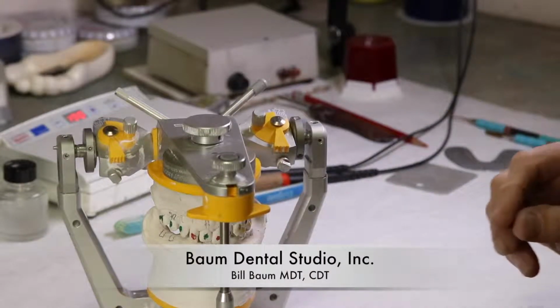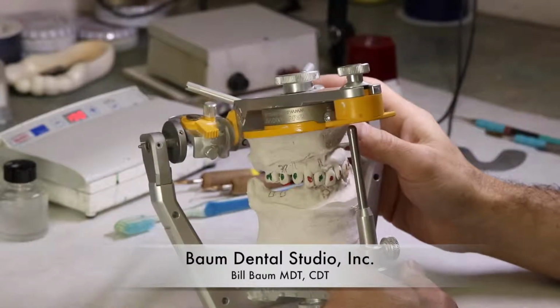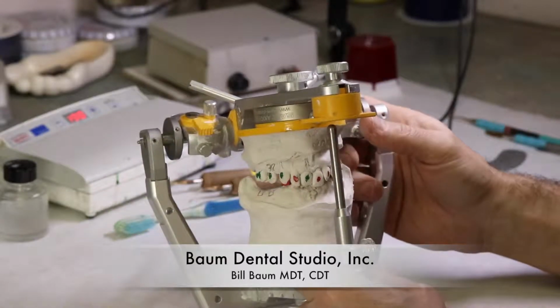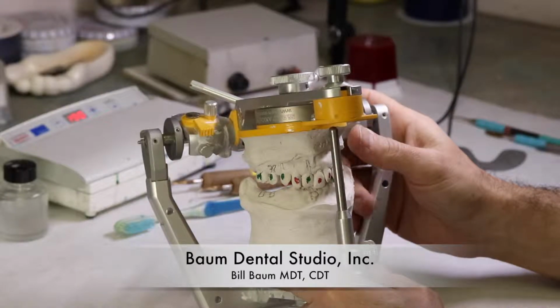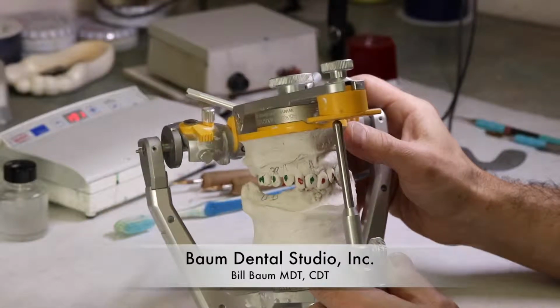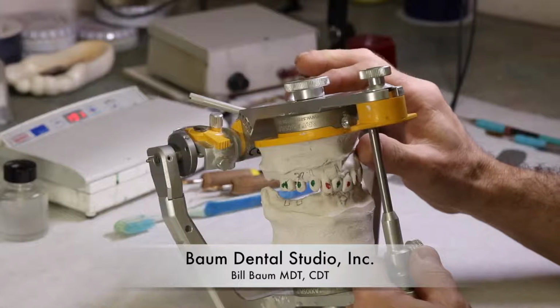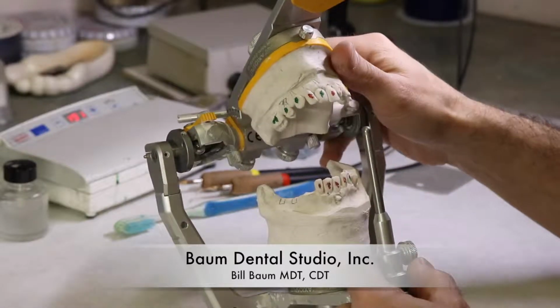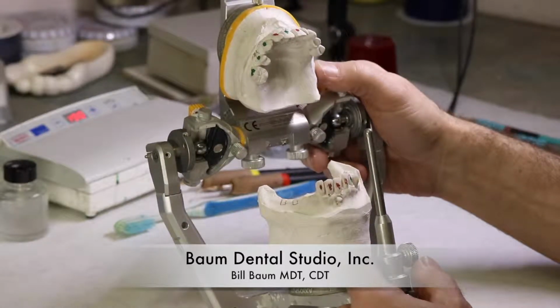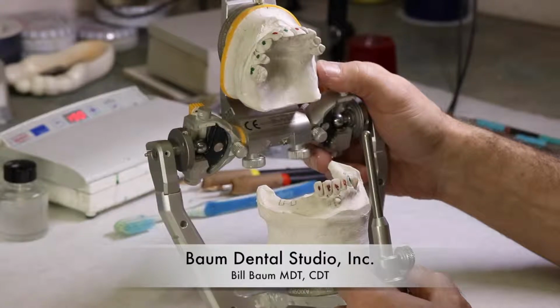Everybody, so today I wanted to do a little case presentation on this full mouth rehabilitation that I am embarking on. The dentist discussed treatment plans and goals and desires. And what was concluded is that the dentist is pursuing a fixed natural tooth and implant supported full mouth rehabilitation.